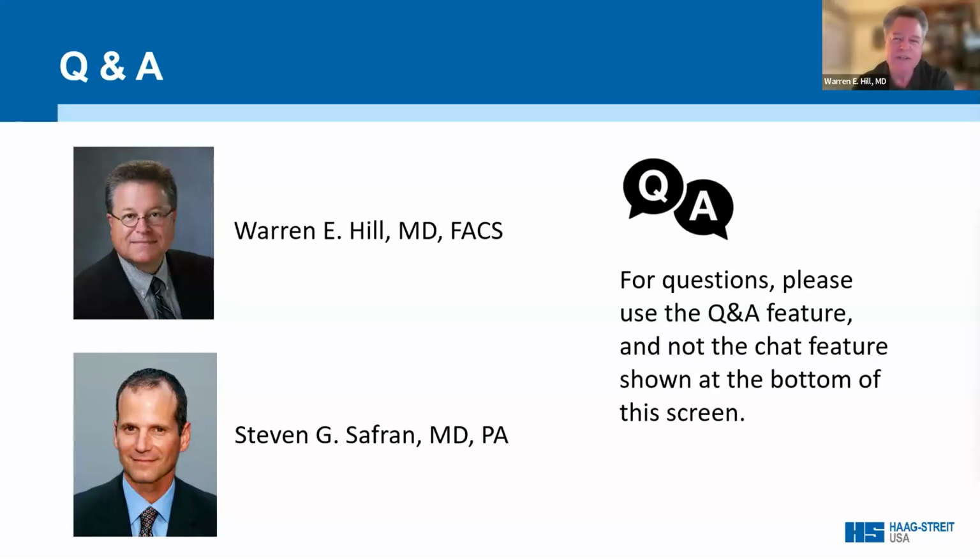One other thing that we started doing about 2 or 3 years ago has really transformed things for us, and if you track your outcomes, I can guarantee you this will give you probably another 3 to 5% increase in the accuracy of your half diopter outcomes: optimizing the ocular surface before you do biometry. Our cataract patients are elderly, and I live in the desert, so big surprise, everybody has dry eye. But when you do a topographic axial curvature map, all those small steep and flat islands go away. The measurement to measurement variability on keratometry goes away. And the patients even comment, gee, my vision's so much better.